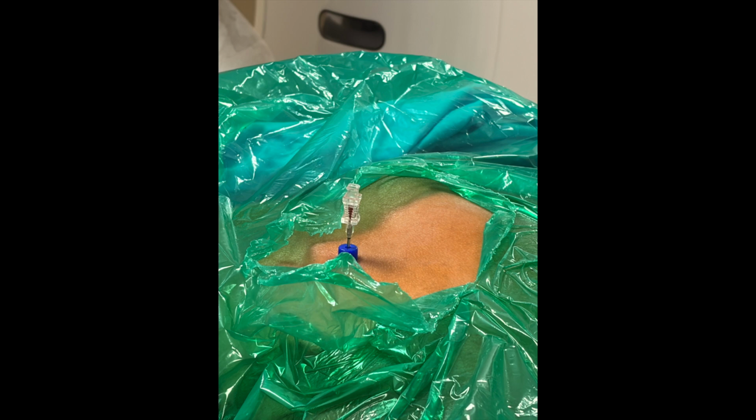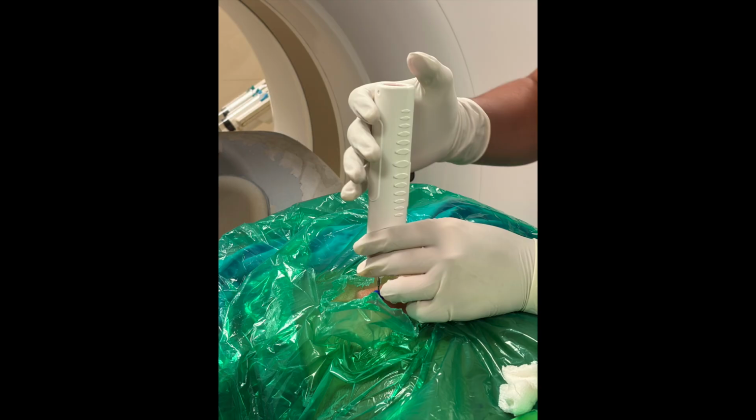And now we have placed it, and we have removed the stylet of the coaxial needle. And now we have passed the automatic gun through it. And we will take only 4 cores from it.